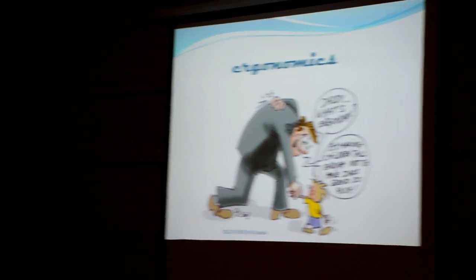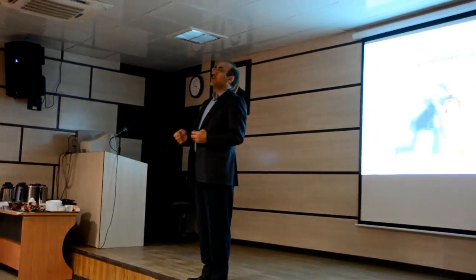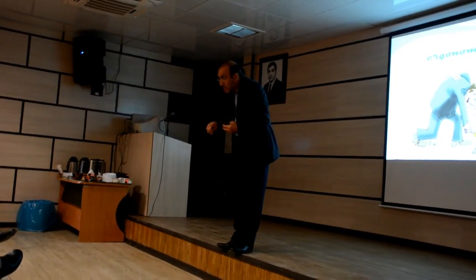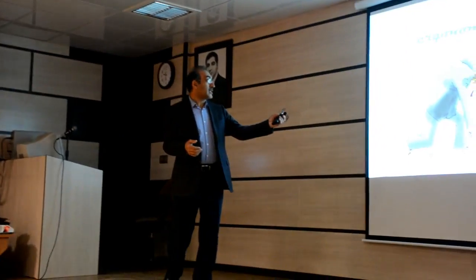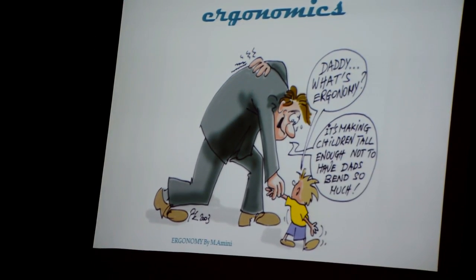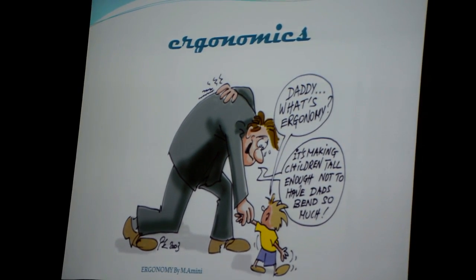As you know, in laparoscopy, someone thinks that laparoscopy is so much easier, you stand up, not bend, so you work like this and it's easier. Most old surgeons like me have discopathy of the neck because of this situation during very long periods of operation. As in this joke, the small child asked his daddy, "Daddy, what is ergonomics?" He replied that it's making children tall enough not to have dads bend so.